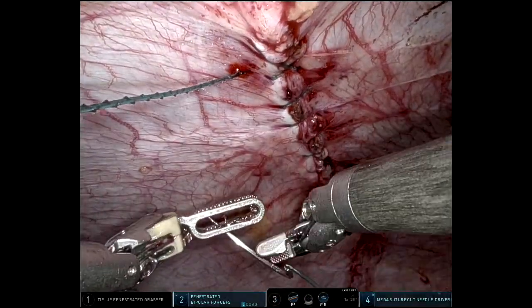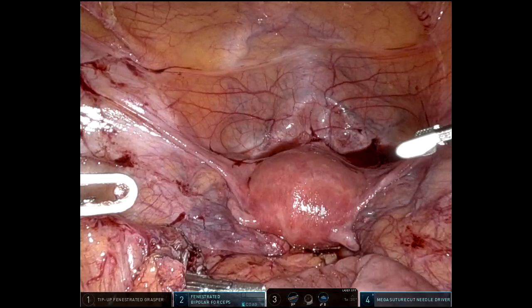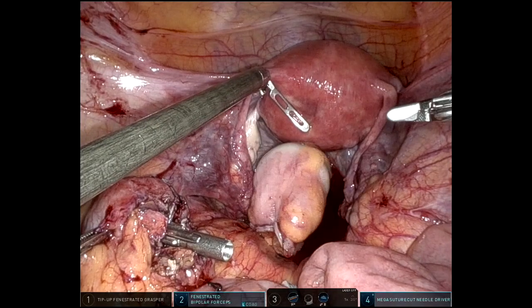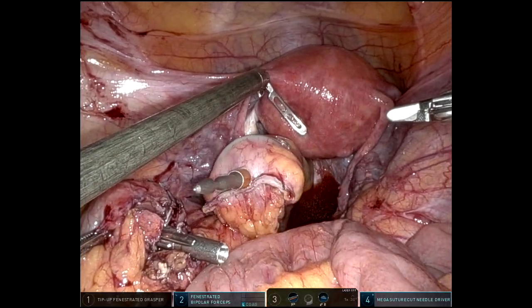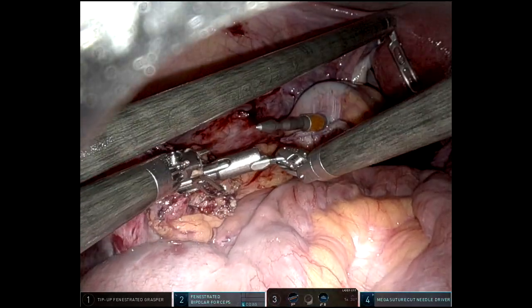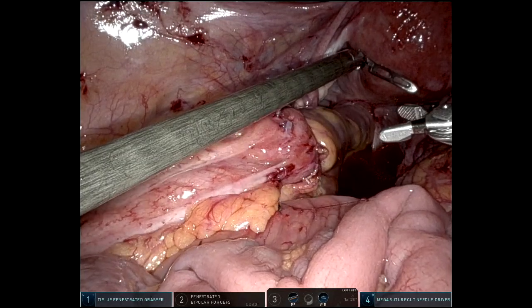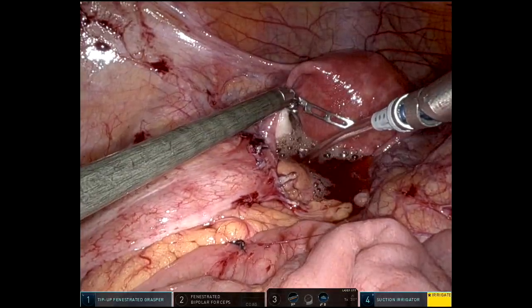Running it back a couple of throws to lock it in place and then we'll get to the anastomosis. I'm passing the rectal sizers — did the 25, to the 29, to the 33. I placed a 29 anvil based on sizing, so the 29 EEA stapler came up easily. It just seemed to nicely lend itself to an end-to-end here. I'm running back and forth from between the patient's legs to the robot, doing the anastomosis.